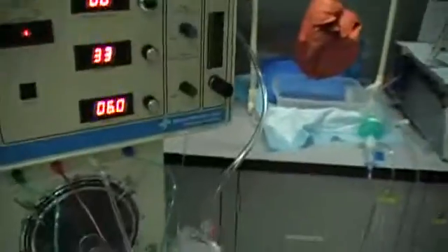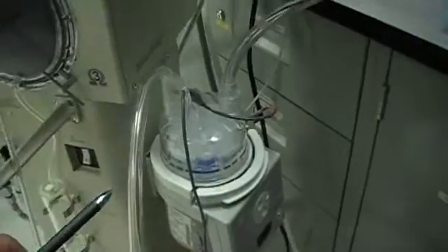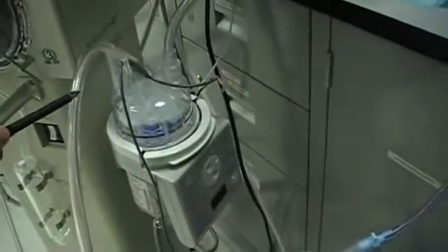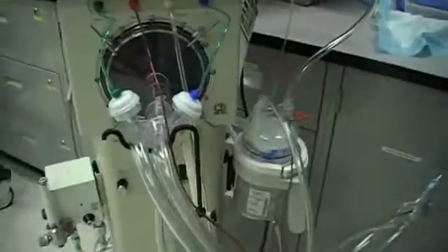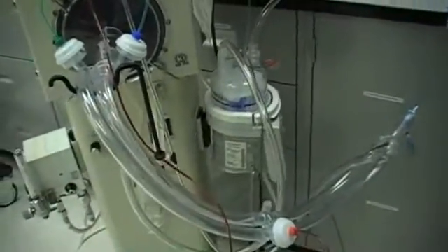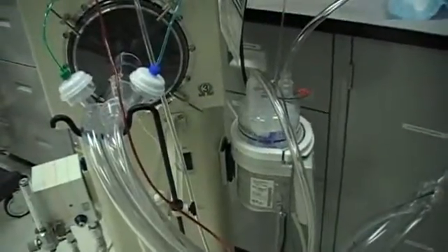As we come up to the high frequency oscillator, you can see that we've got an active humidity circuit here. This is true of all oscillators — it's very drying to the airways and we tend to have a lot of problems with retained secretions, so we always use an active humidity system. One of the other benefits is that we don't need to use as many filters, and we don't lose compressible volume due to having air going through a filter.